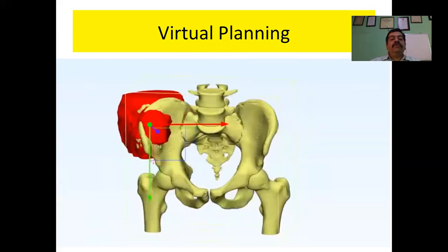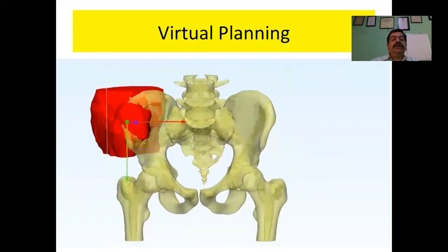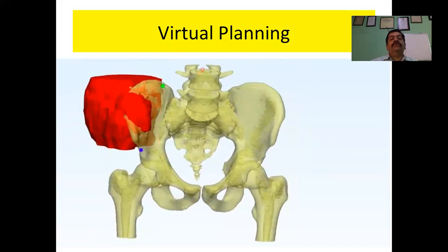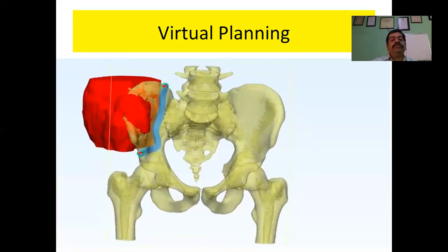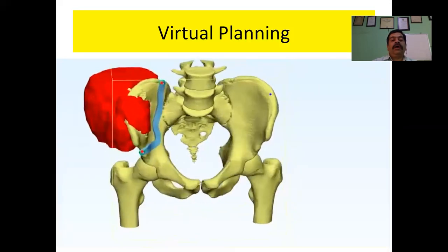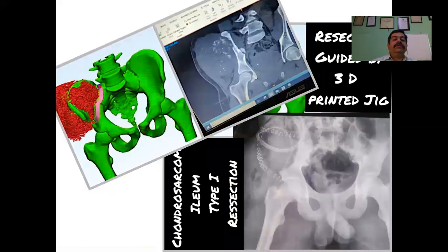So once you've got the fused model, you can easily make out the margins where the tumor exists and then mark it out using your surgical planning tools on where the resection margin should be to give you an absolute R0 resection. So you can print a 3D template, which ultimately can be used intraoperatively to guide your saw and your guide wires to do the surgical cut. So this is what has been done in this patient, in which the acetabulum could be saved and the surgery time could be reduced just because of the understanding of the whole disease which we were dealing with.